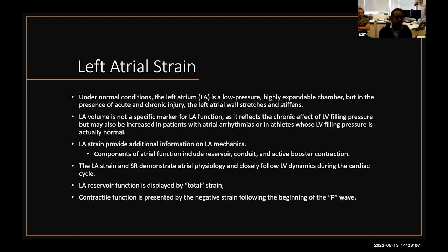But in the presence of acute or chronic injury, the left atrial wall stretches and stiffens. Now, LA volume is not really a marker of LA function, and it reflects more the chronic changes of LV filling pressures, but it may be increased in patients with atrial arrhythmias or in athletes whose filling pressures are actually normal.